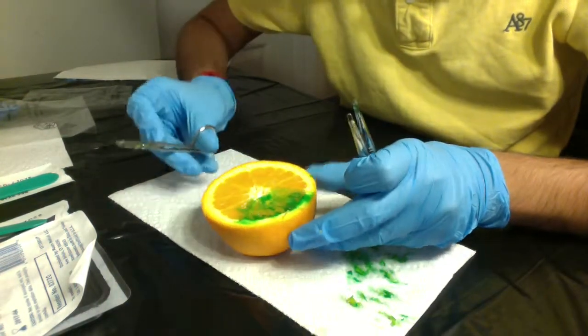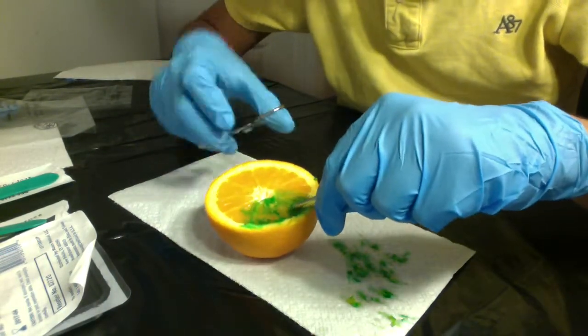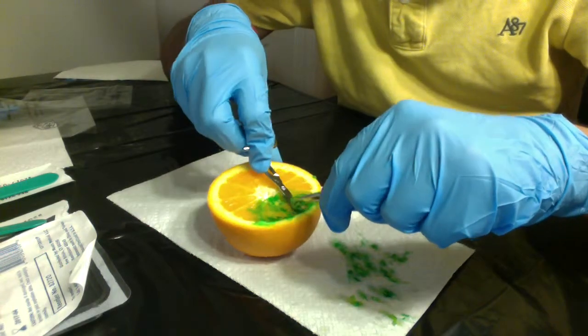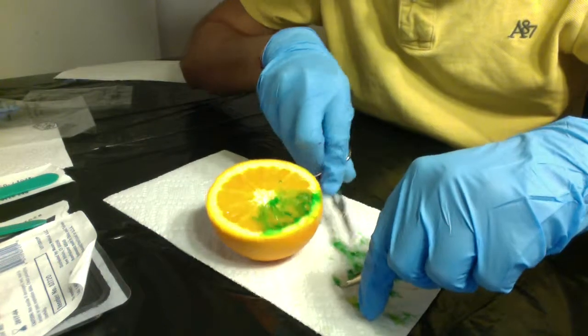Again, I found it a little difficult to keep my arms rested, which might fatigue me easily because I'm keeping my shoulders and elbows up.